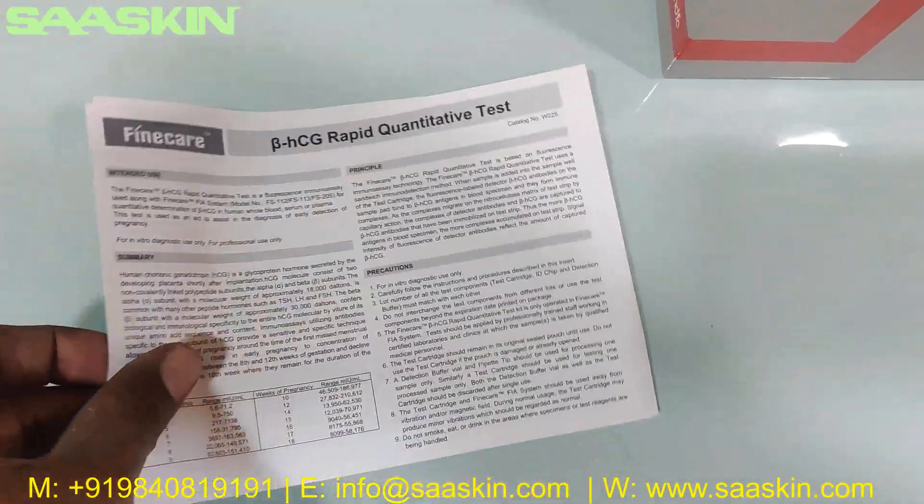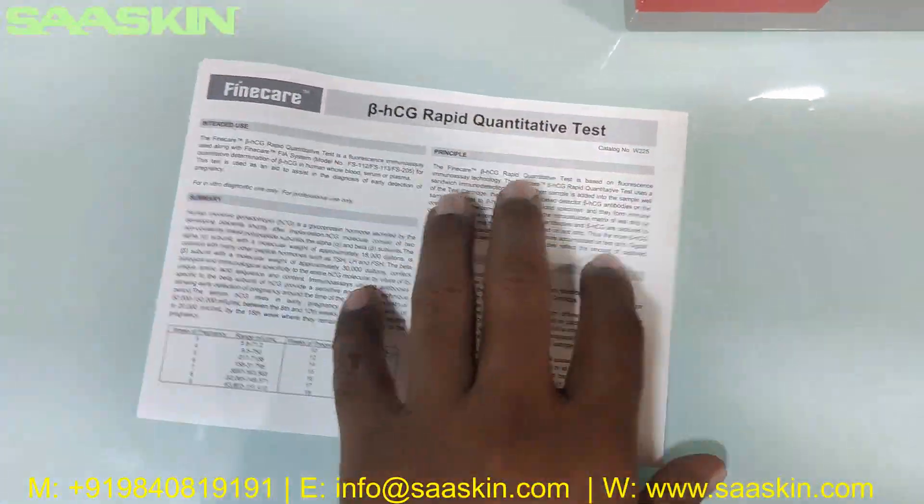This leaflet has complete details about the test procedures and test conducting method and how to interpret your results. You have the complete details to complete this test process.